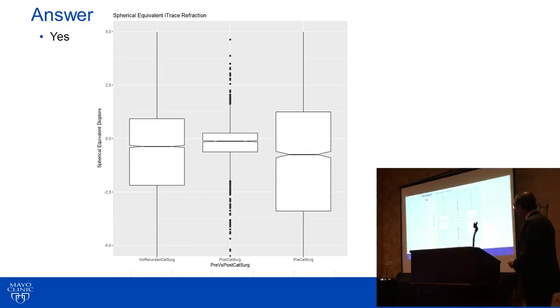The box plot is such that basically 25% to 75% of the patients had a spherical equivalent in the range of this box. 95% of the patients go to kind of the tails of the whisker. The horizontal line is the median, and the notch in the line represents a 95% confidence interval estimate for that median. So what you see is basically in the patients in general, about 3/4 have a myopic spherical equivalent, about 1/4 are hyperopic, with a pretty big distribution.